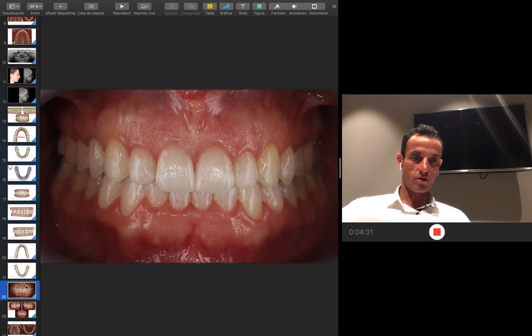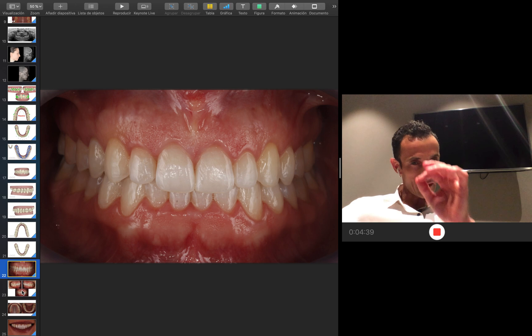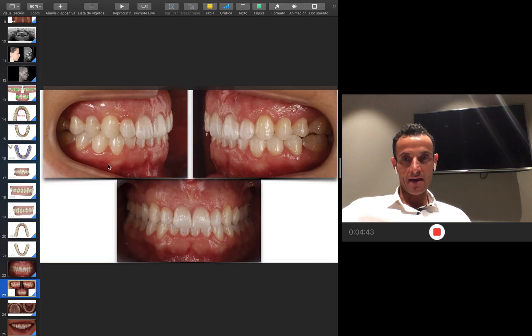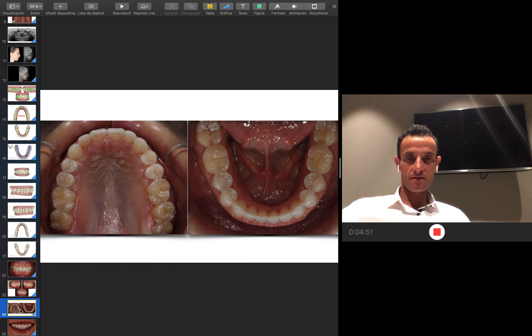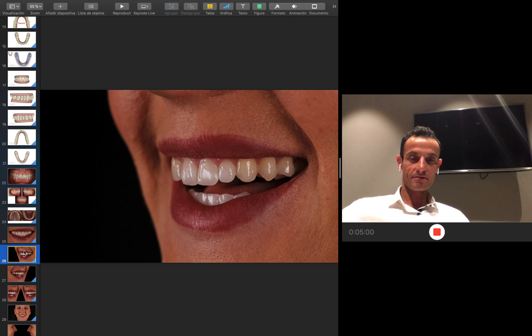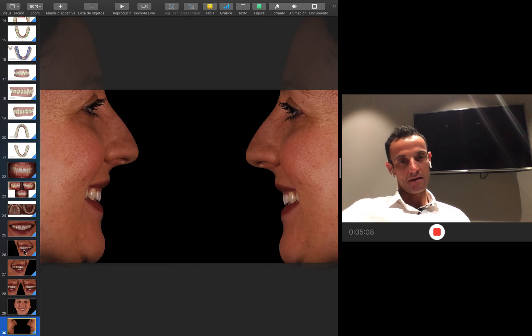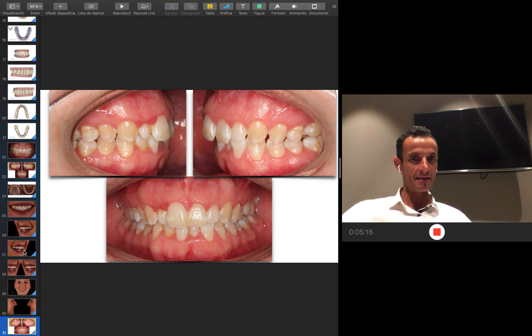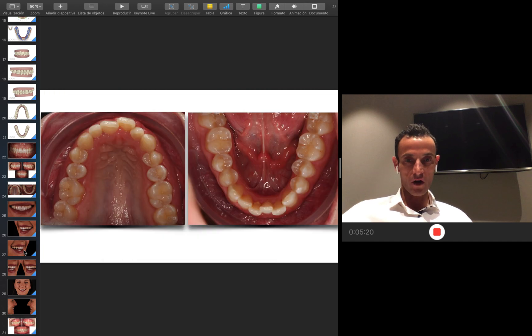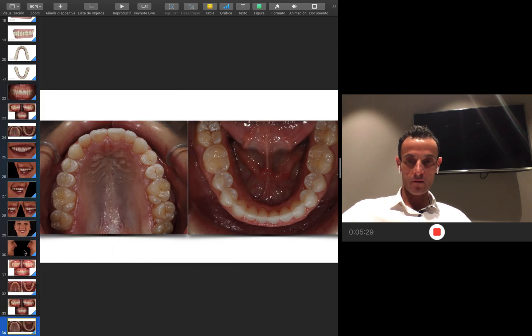Do you want to see the final result? Look at this beautiful alignment at the end — beautiful shape, I did some contouring of the gum, and at the end you have a Class I bilateral in both sides. The final arches are parabolic and coordinated. Look at the beautiful full-mouth smile. Fantastic result — the torque is balanced with the face. We started with deep bite, crowding, severe Class II in both sides, midline deviation, and narrow arches upper and lower, to finish with this beautiful Class I bilateral, good engagement, centered midline, and parabolic shapes of both arches.